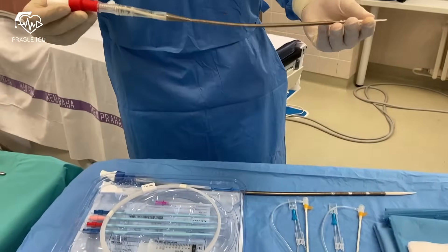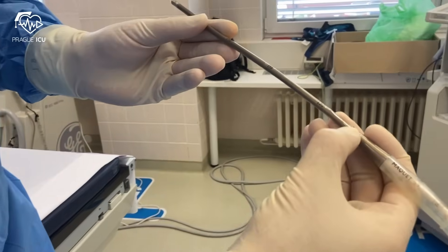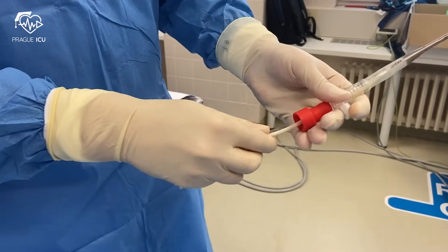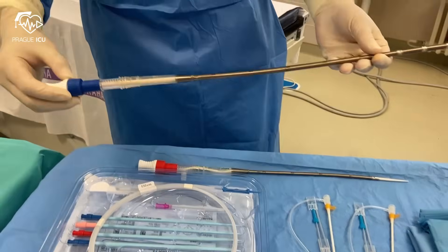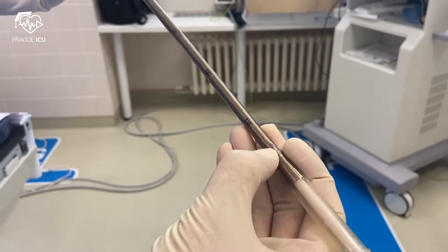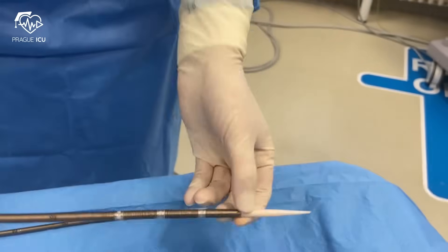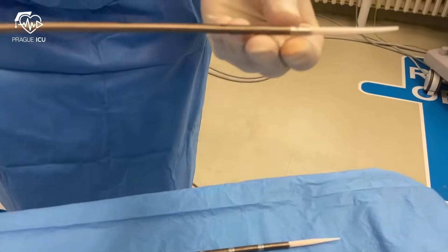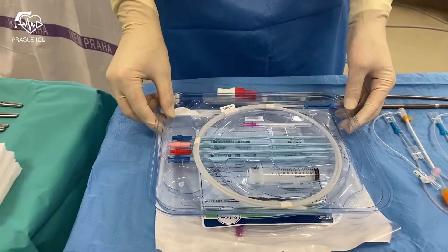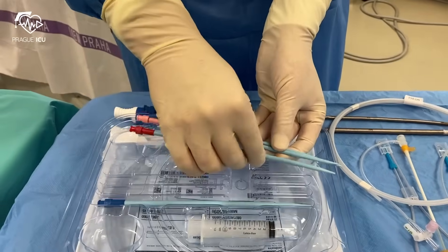The VA ECMO arterial cannula is shorter than the venous one. Its size is usually between 15 to 19 French, measuring between 20 to 25 centimeters, and contains an introducer. The larger venous cannula is usually approximately 35 to 40 centimeters long and their size is between 21 to 25 French. Venous drainage cannulas have multiple side holes at several different levels and also one large lumen at the end. In contrast, the arterial cannula has just the terminal return holes at the tip. The ECMO cannulation tray includes an introducer needle, wire, and a set of dilators with different sizes.